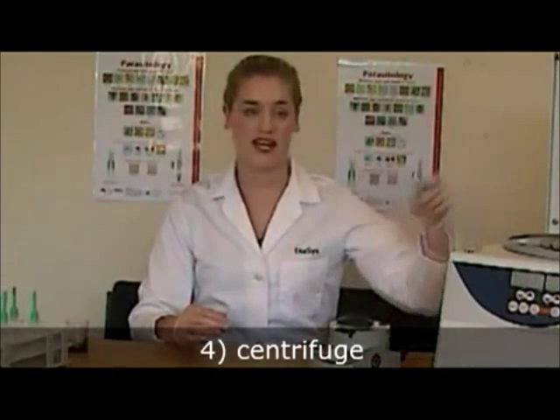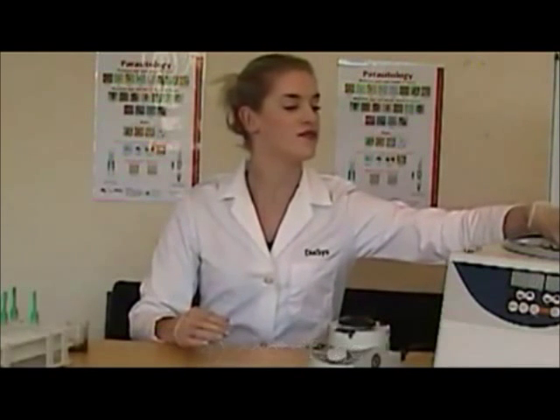Place the Paracep directly into the centrifuge. The time will depend on what Paracep you are using, but today I am using the Mini Paracep SF reagent ready, so two minutes at 500 Gs.